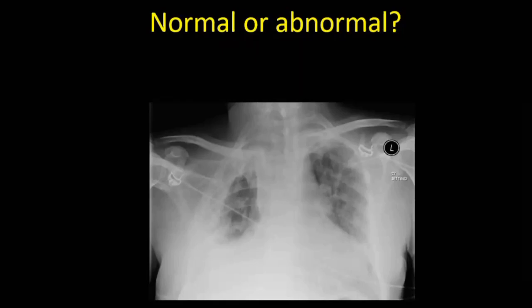Excellent. So a link from the bronchial stump through... Exactly. What else? Could it be, thirdly, iatrogenic from insertion of a tube? Yes, it could be. I'm basically concerned about all the post-operative causes of the air. That is iatrogenic, infectious, leaks, bronchopleural fistula formation.